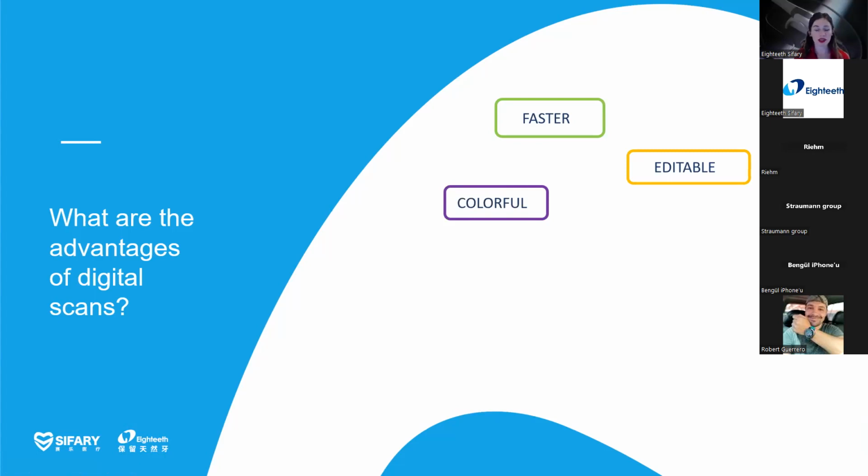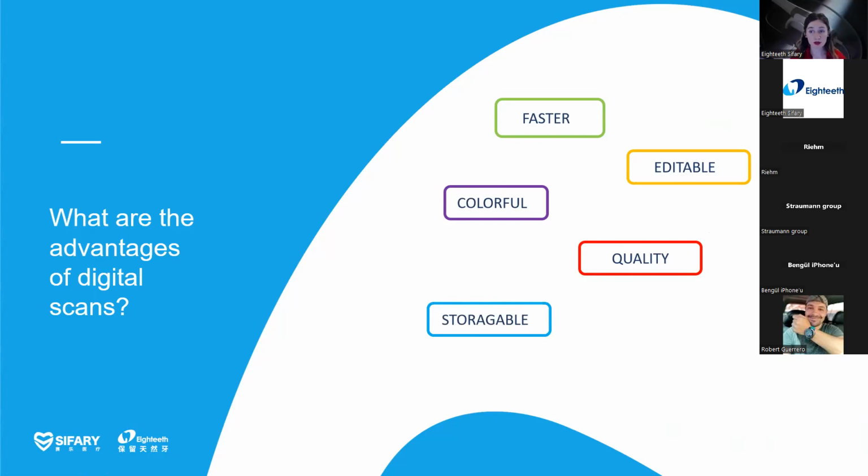And we are going to provide the dental laboratory a colorful model. And it's definitely going to be higher quality. I mentioned that there can be a lot of material and human errors, and with intraoral scanners we eliminate most of them, believe me. And it's going to be storable.